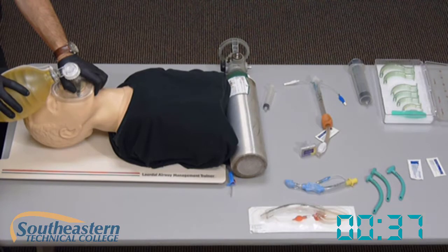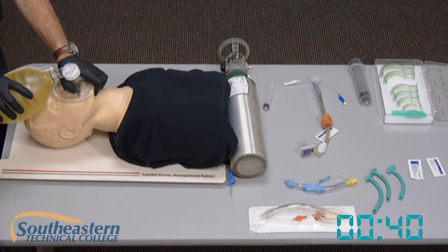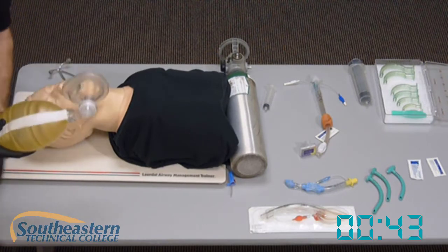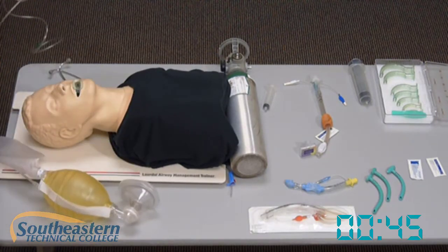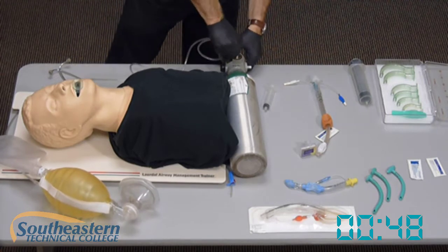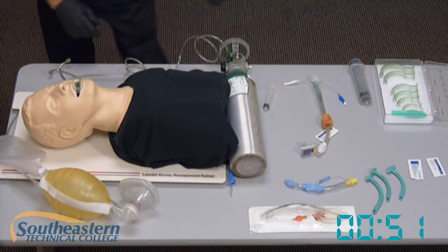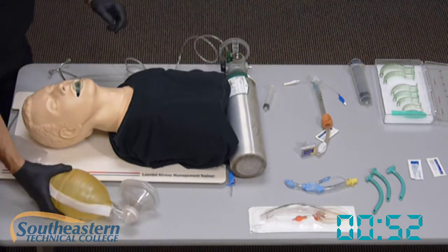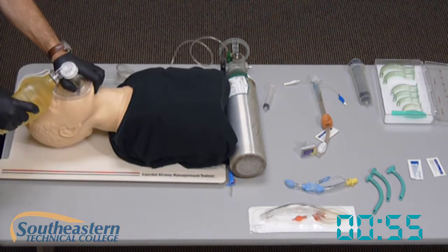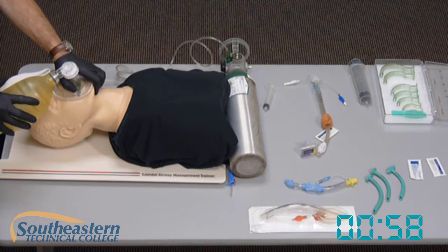Pulse oximetry shows that the patient's O2 sat is 85 percent. I'm going to attach my BVM to supplemental oxygen, setting that at 15 liters per minute. I'm continuing with my ventilations at 10 to 12 times per minute, once every five to six seconds.